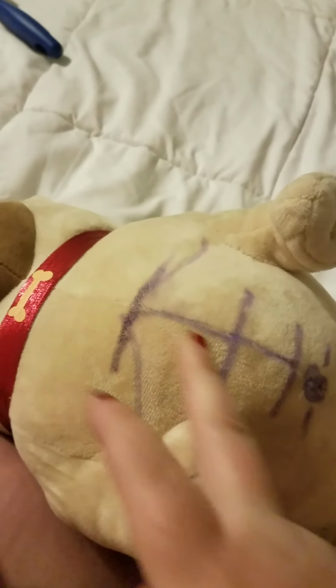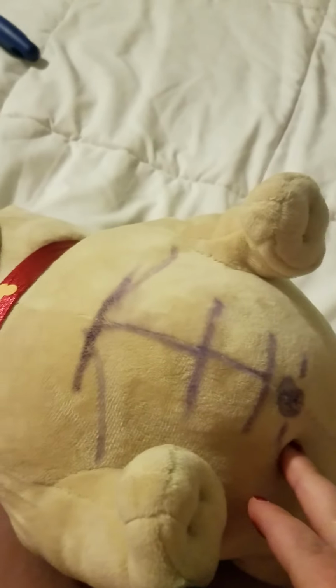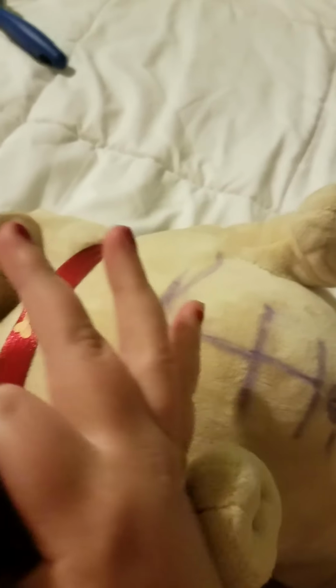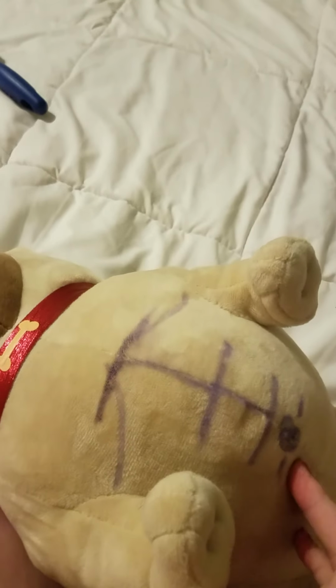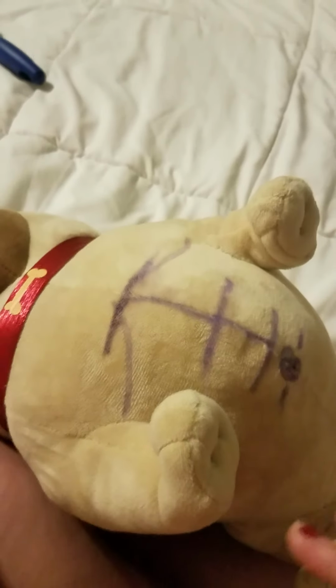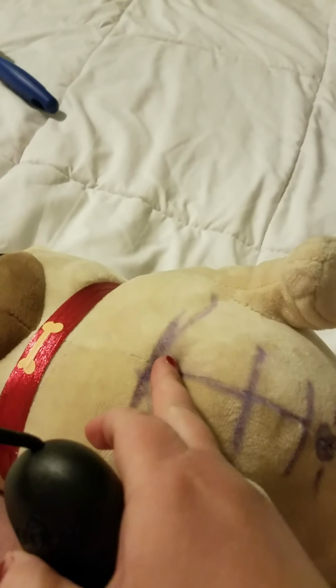Okay, so I have my daughter's stuffed rolly toy here. I drew it out where your midline is so that you can see it on here, because you're going to be taking measurements at proximal, mid, distal, and then at your iliac artery bifurcation down here. So if you can see that, I tried to draw in the rib cage. So you're going to be underneath the rib cage for this proximal segment.